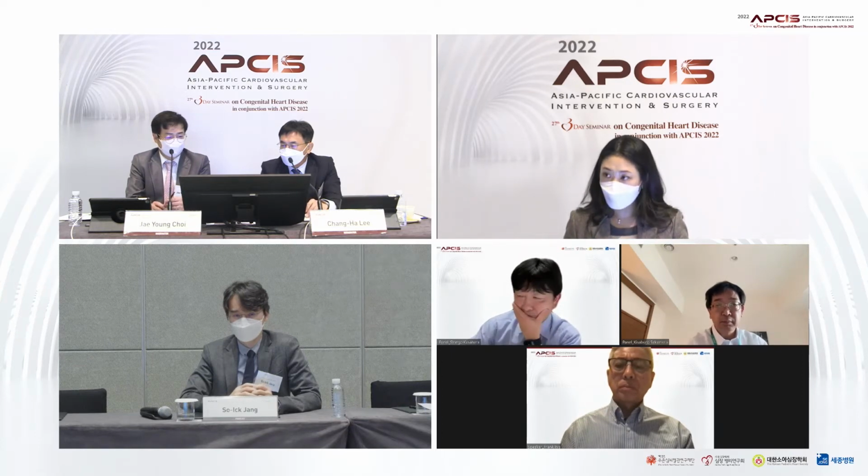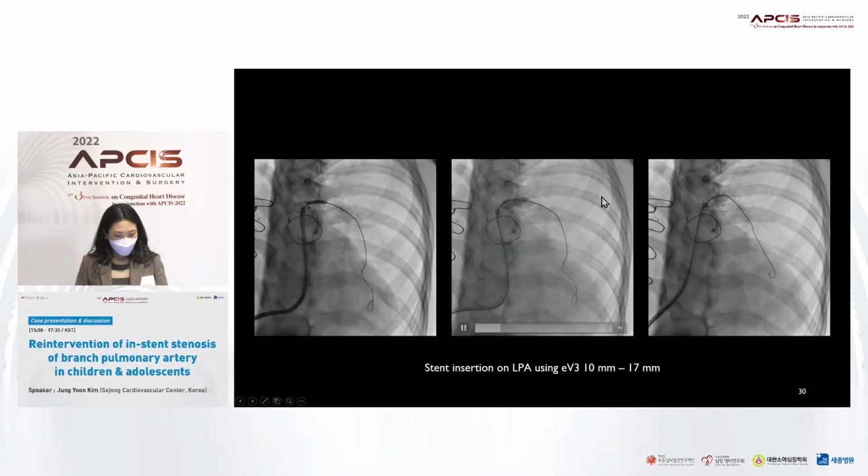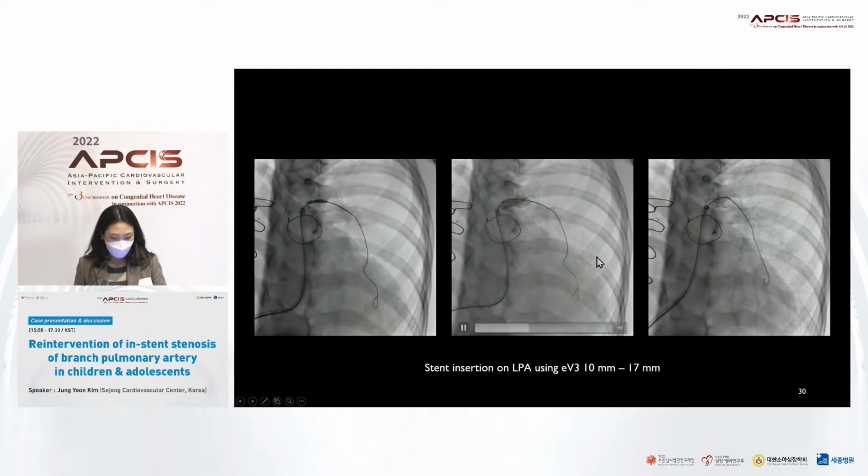Back to my PPT. We put the stent again in the LPA, an EV3 10 millimeter by 17 millimeter length.